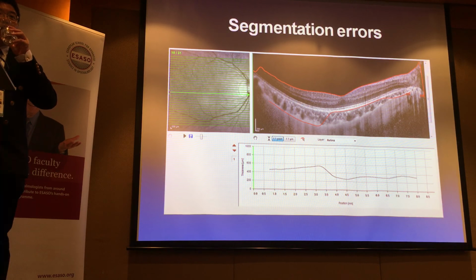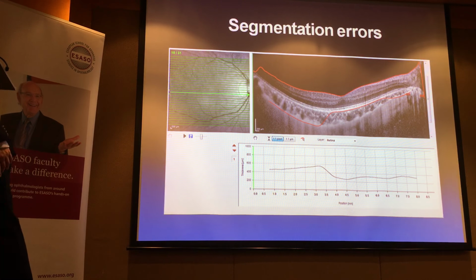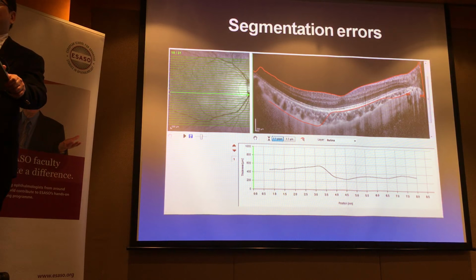Sir Colin, my hospital uses the spectral domain, but after surgery, I'm unable to image patients with a gas-filled eye. What is the technique if you want to capture a good OCT in a gas-filled eye? Okay, that's a bit challenging.